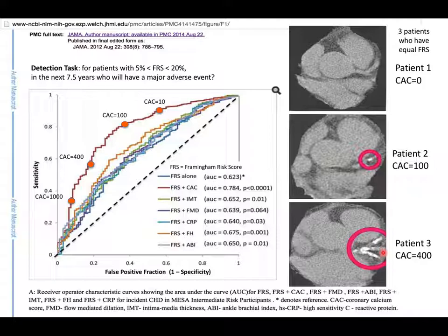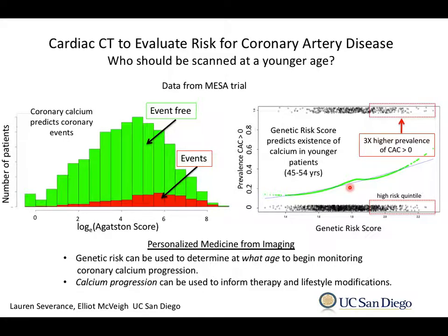So if you're a young person, you know, not 25, but if you're like 40 and you have a history of cardiovascular disease in your family, it's probably worth having a calcium scan because they're cheap and there's no contrast or anything like that. And then if you saw this, you say, oh, okay, I should probably talk to a physician about going on a statin. Statins are off patent now, so they're cheap, right? So it costs about 15 cents a day or something, 25 cents a day. That wasn't the case 10 years ago. 10 years ago, it was pretty expensive.